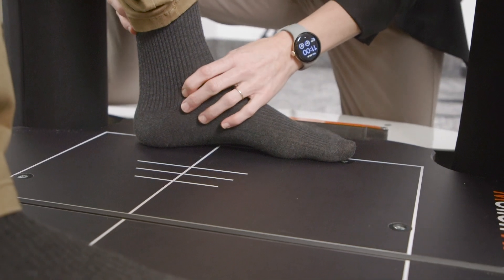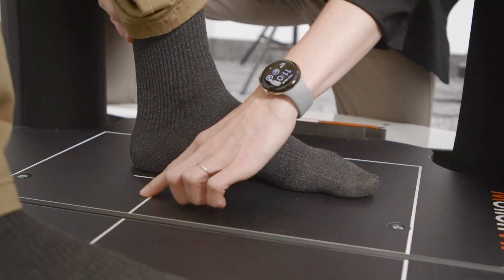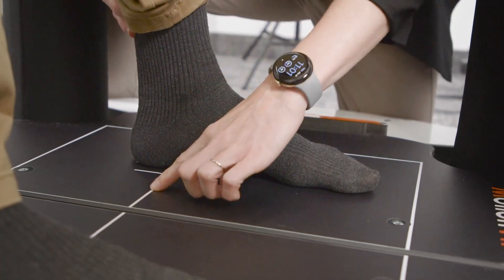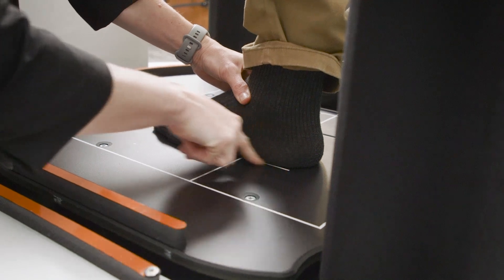Center the patient's feet on the force plate. The front edge of the medial malleolus of each foot should be directly centered on the horizontal line of the force plate. The outer edge of the foot should be aligned with the antero-posterior lines.